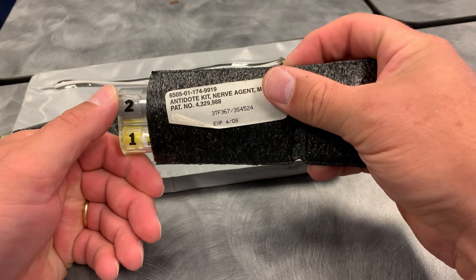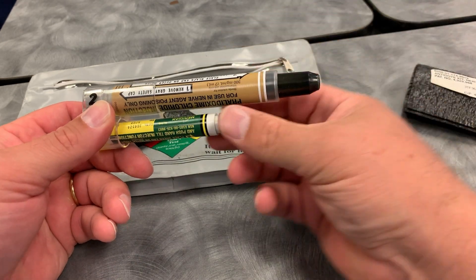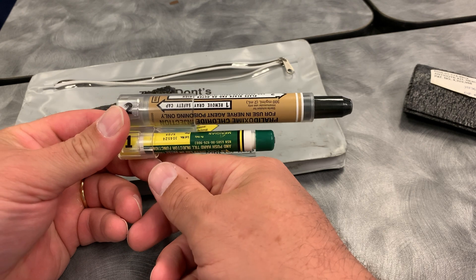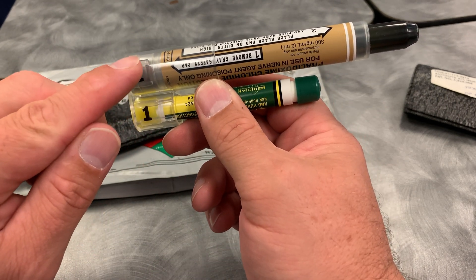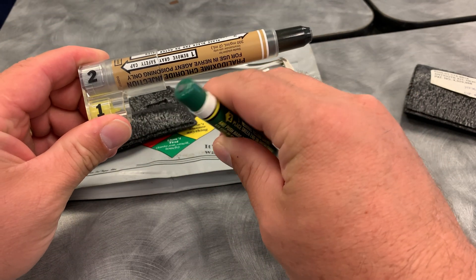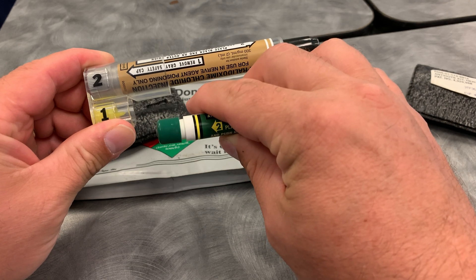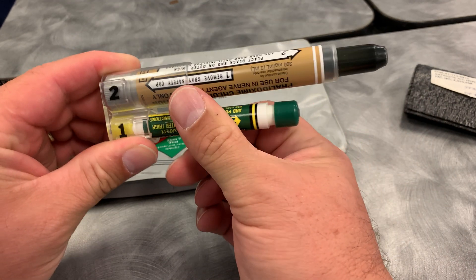To use these, it's very simple — they're labeled one and two. Take the cover off and inside are the two auto-injectors. The caps are embedded in the case, so when you pull out number one it's already active and ready to go. The green part goes against your thigh, and just like an EpiPen you press it in until it ejects. When you're done, record the time and dispose of it.